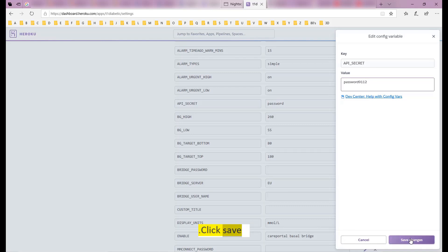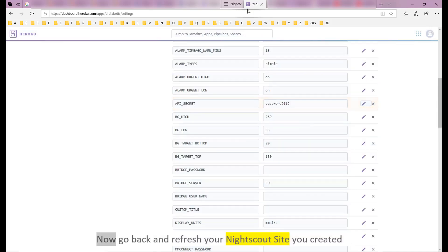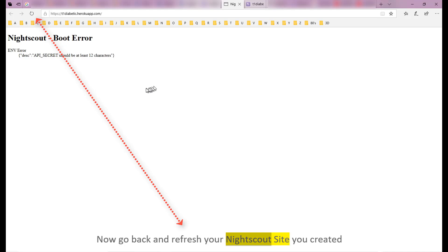Click save. Now go back and refresh your Nightscout site you created.